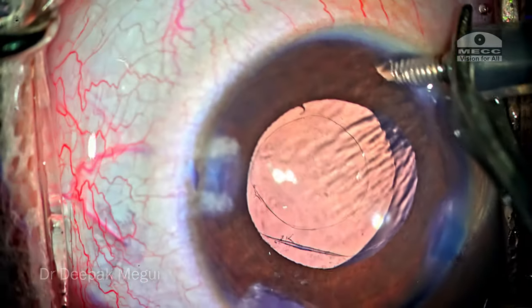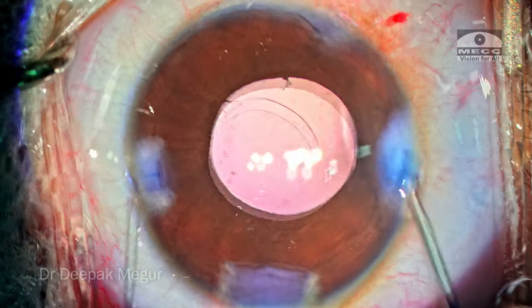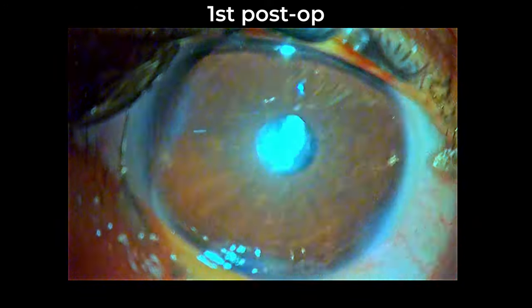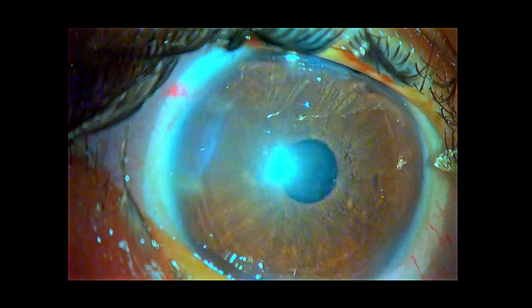The AC maintainer is taken out, the port is hydrated, and the side ports and main incision are hydrated. That's it — the case is done. These are the first-day post-op pictures. The patient is doing reasonably well. I plan to do the second eye surgery in a week's time.